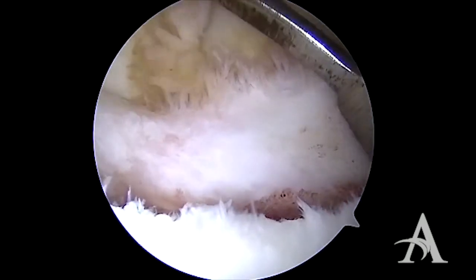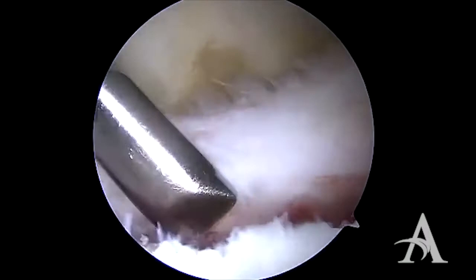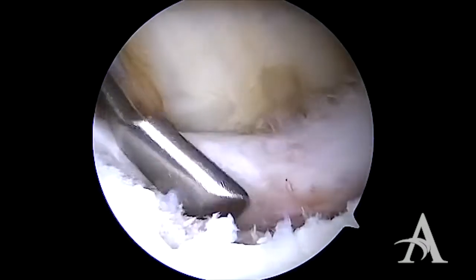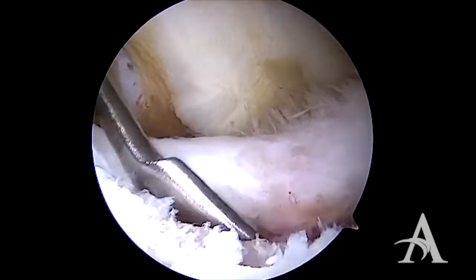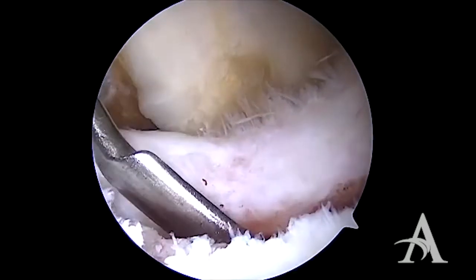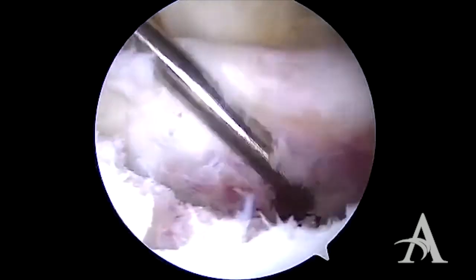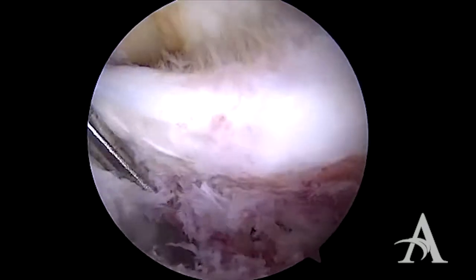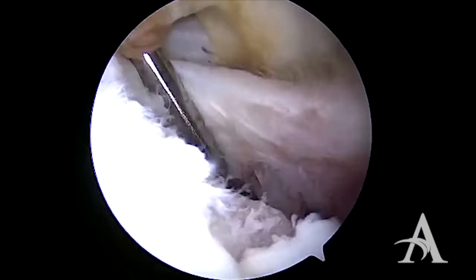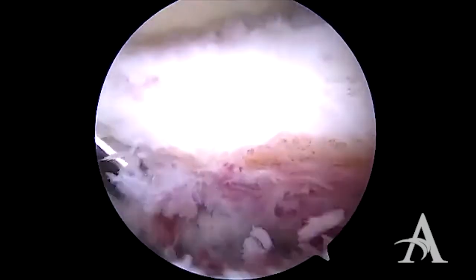The first step in the procedure is to use an elevator to mobilize the soft tissues from the front of the glenoid. The labrum is typically scarred down, often in a medial position. It is important to mobilize the soft tissue and free it up from the glenoid so it can be placed back up onto the face of the glenoid in an anatomic position.